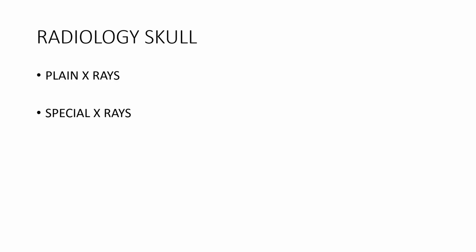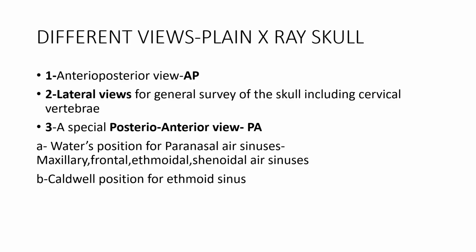But our area of concern is plain x-rays, so we are going to study plain x-rays of the head and neck region, skull and neck region also. There are different views which we study in plain x-ray. What are those? Those are AP views, lateral views, and the PA views.